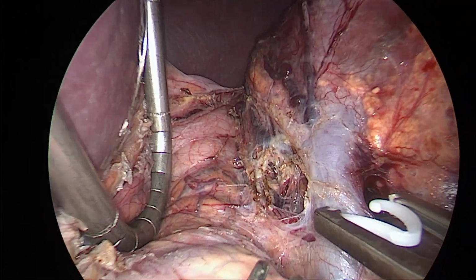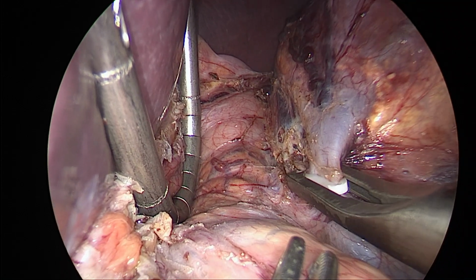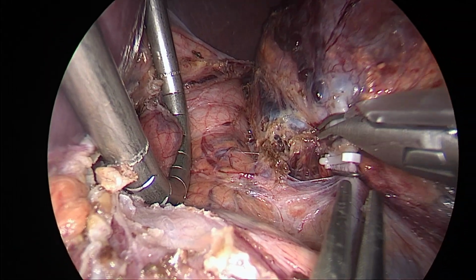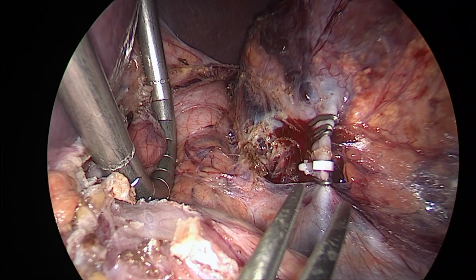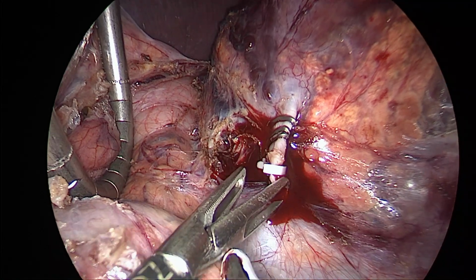The suprarenal vein was clipped with a hemolock clip and several metal clips to then be sealed and separated with the vessel sealer. Even just slightly displaced clips may lead to extensive bleeding, impairing the view of the surgical field.